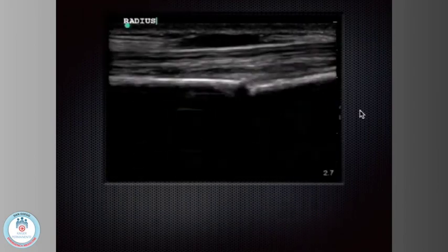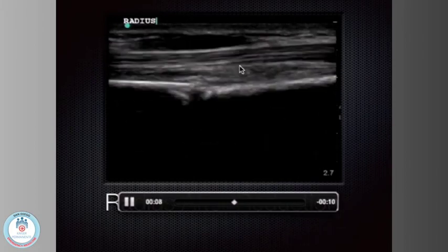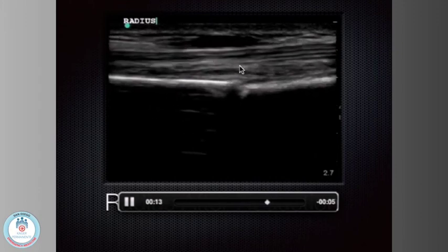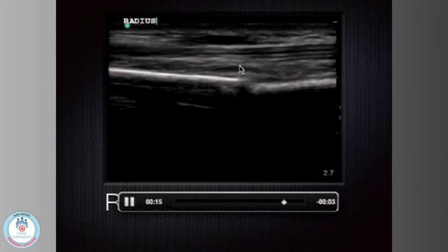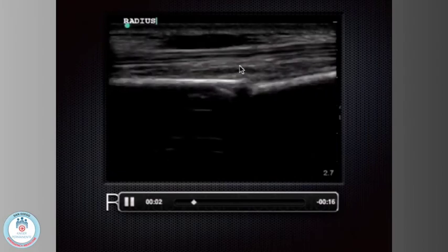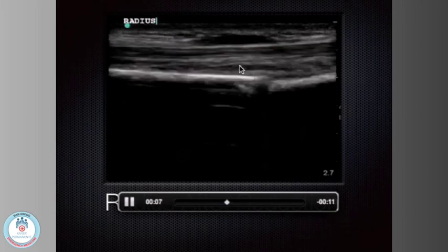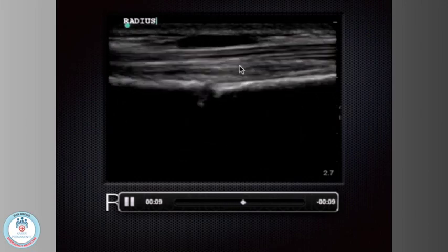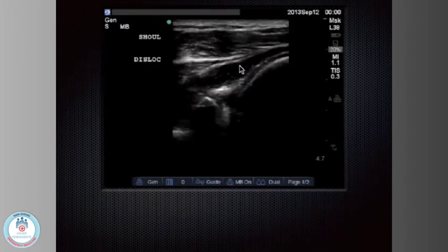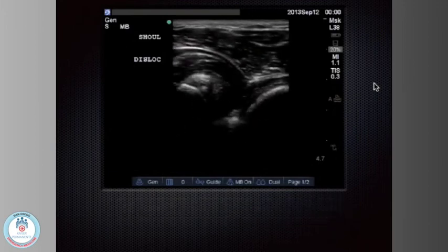This is a broken arm. We did ultrasound reduction until we got the bone ends back together. So yeah, you can put these bone ends back together under ultrasound guidance. Our orthopedic surgeons are all doing this now. We started showing them how to do it, and now they're all asking forward to doing it. So it's kind of like poor man's fluoro, if you will. It takes a bunch of people though. You need someone to do the reduction, someone to hold the probe on the machine, and someone to deal with the patient's pain and stuff. But you can do these ultrasound guided reductions. This is a shoulder going in and out here.